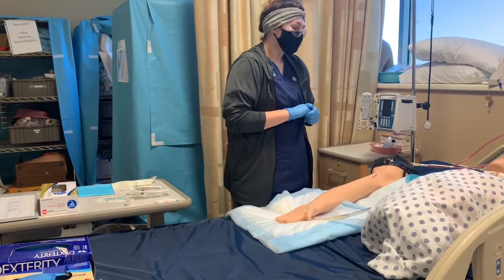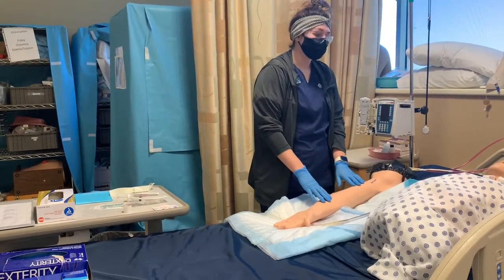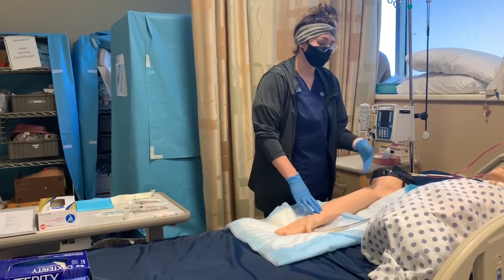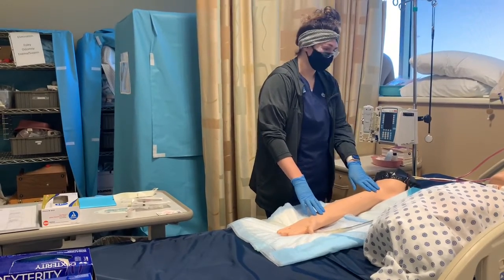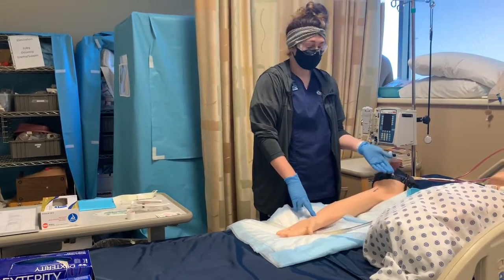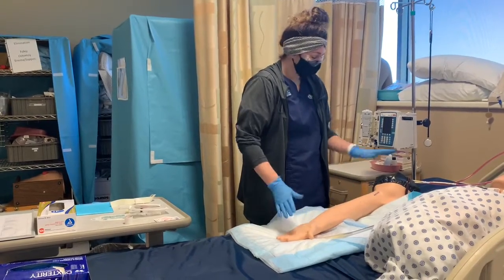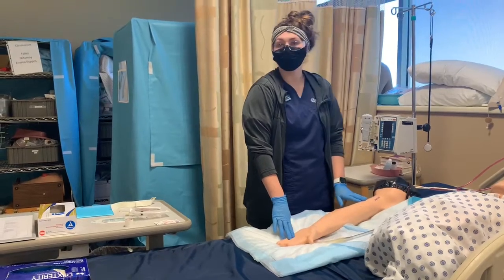You're good to go. I then assess the arm, and I ask her if she's had any recent surgeries or fistulas, or if she's ever had a mastectomy on that side, preferably the non-dominant arm. And she says she has not, so we're good to go there. I also want to make sure that, in conversing with her, she's able to follow my commands. I ask her if she can keep her arm out straight, and she says yes, and she's not going to move her arm while I do the insertion.